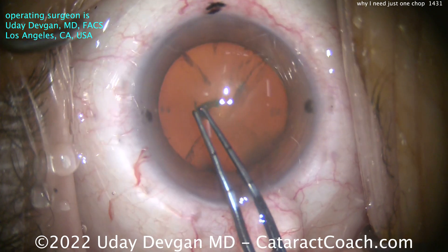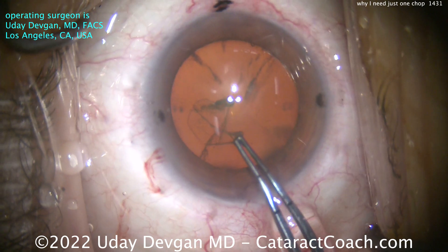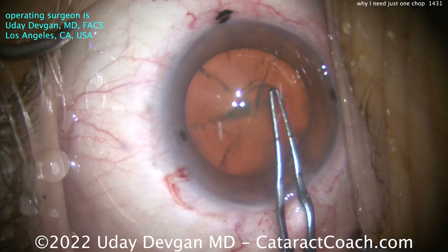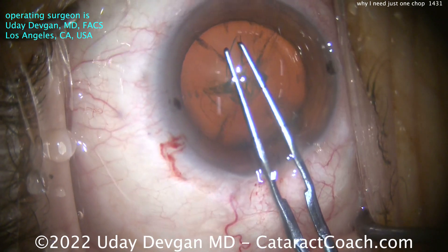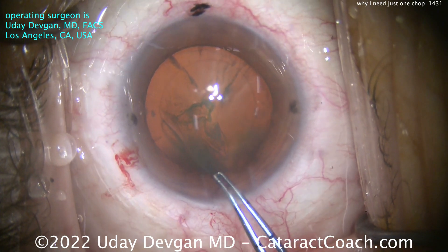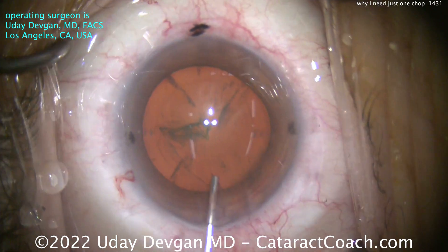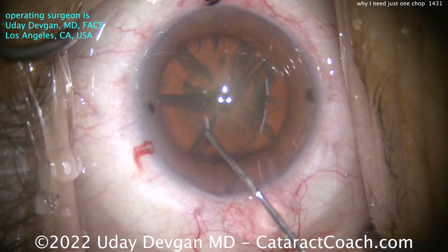The second thing is the rexis. In order to get a hemi-nucleus out of the bag, we need to have a sufficiently large capsular rexis. If you make a small rexis — let's say 4.5 millimeters in diameter — you can divide the nucleus into quadrants and take each quadrant out. But if you want to get a whole hemi-nucleus up, you need about a 5-millimeter rexis, which will allow us to bring a hemi-nucleus fragment — a whole half — out of the bag.